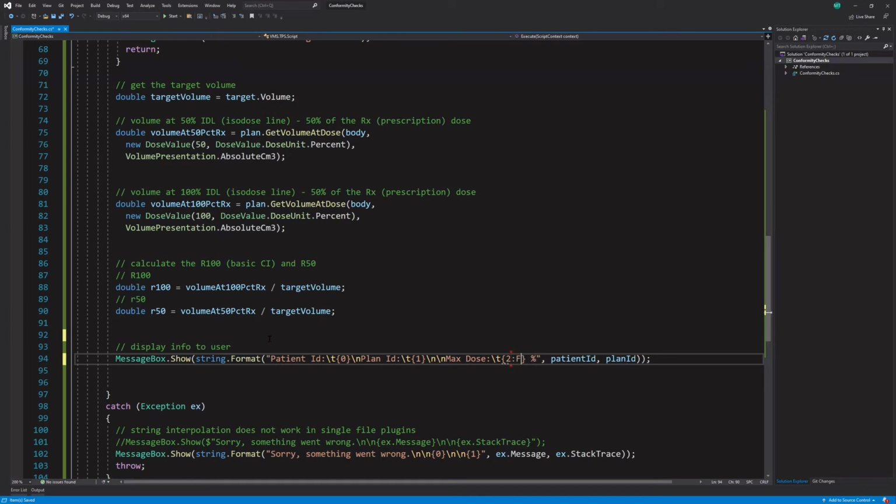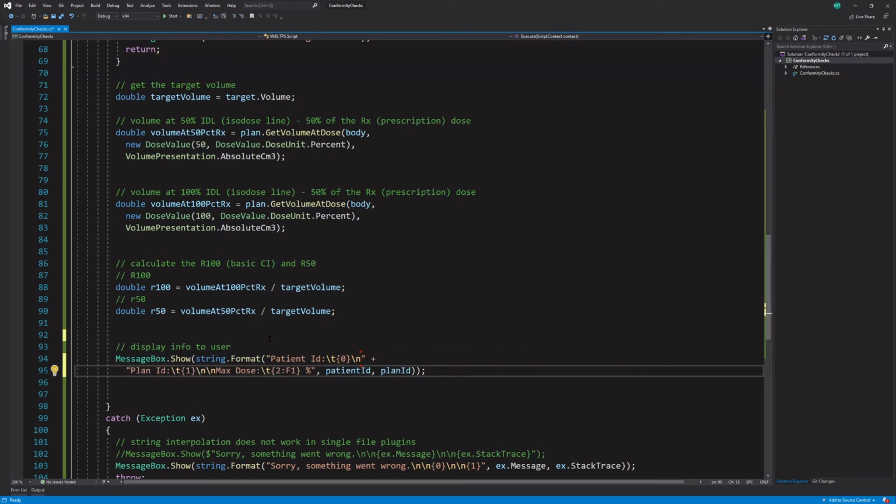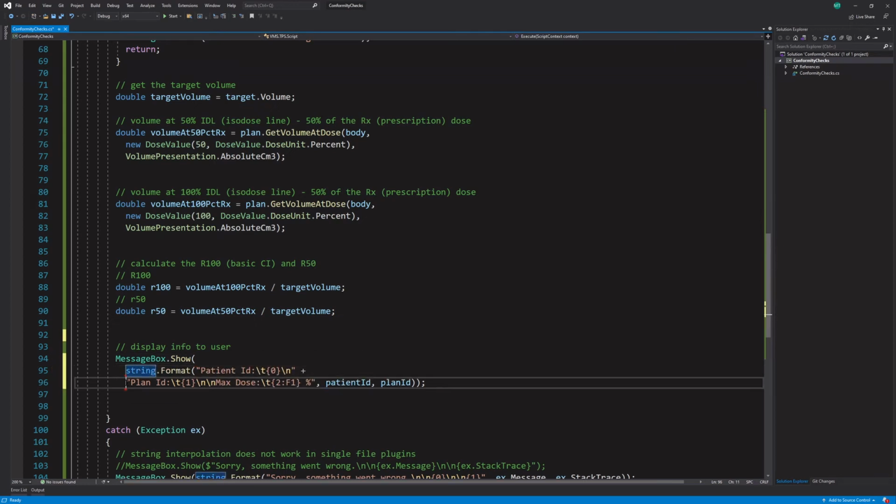So it's in percentage, so let's give it only 1 decimal place. The other thing we could do is just round the value, but you can also do a string format right here. Okay, and then before we, let's space this out a little bit. So I hit enter after this new line, right? Because we're adding a new line, and if you wanted to, we could do this, and then space this out like this. And so now we've got our new lines.